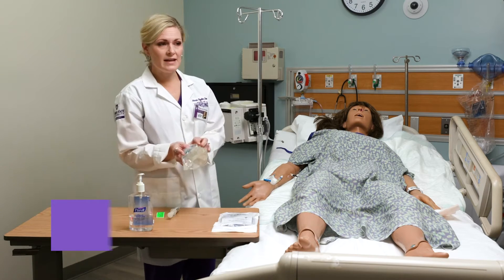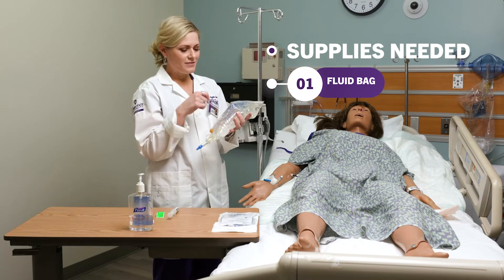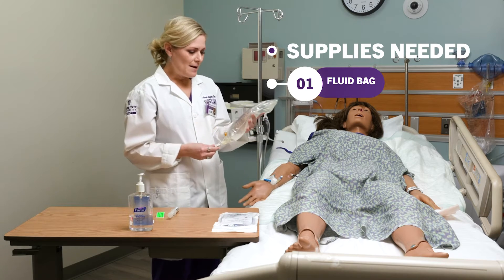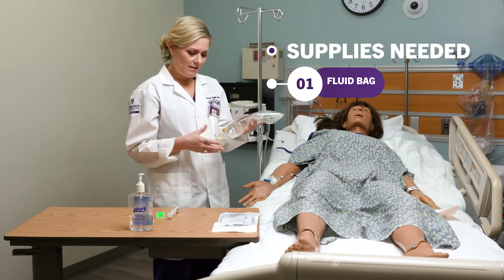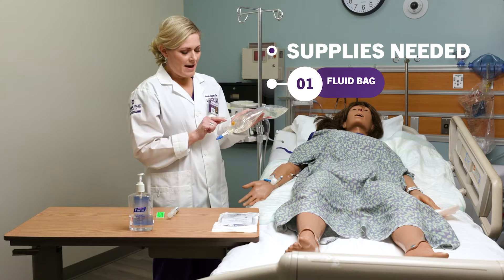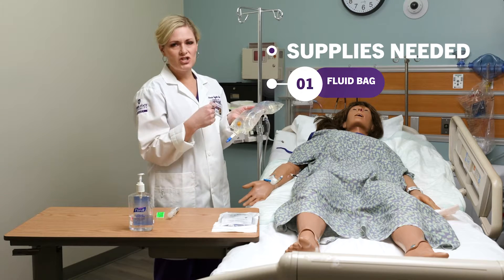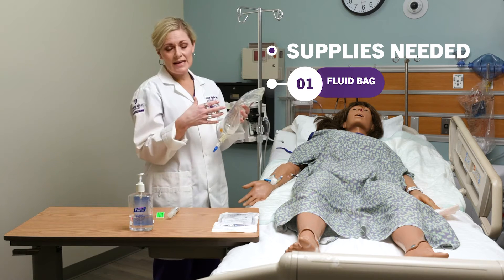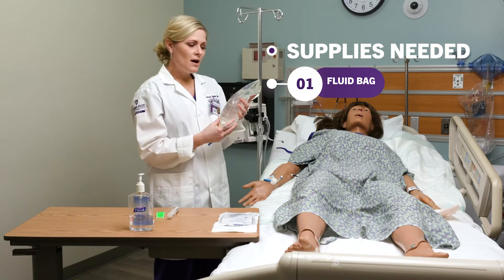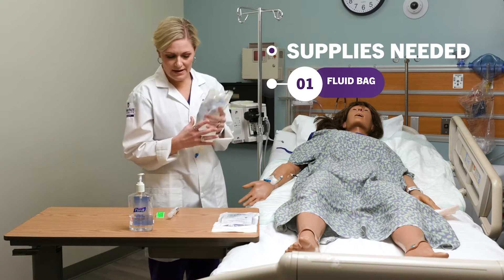I'm going to need my fluid, whatever that is. It usually comes in a bag on the outside that you'll have to open. Your bag may look different — lots of IV bags may have different ports and things like that. It may have a little hub to inject medication if needed. You're going to want to inspect your bag: make sure it's not expired, not cloudy, and there are no leaks. So I'm going to check my bag before I bring it into my patient's room.